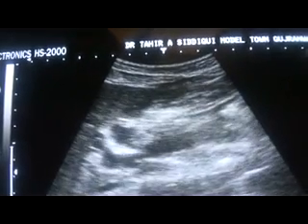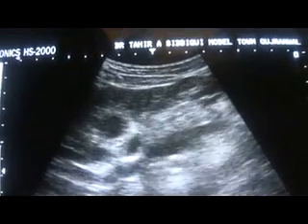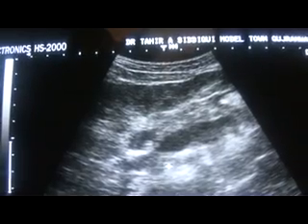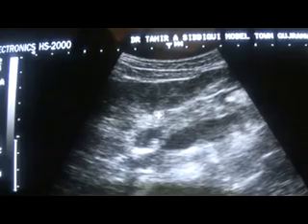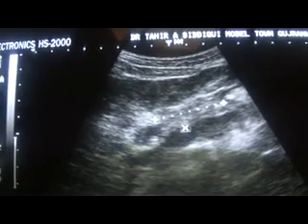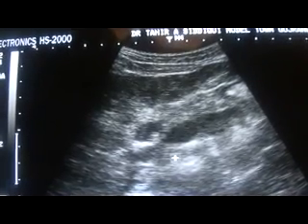This is common bile duct. And this is the liver. So this is the pancreatic head, and you know that the common bile duct crosses the posterior inferior surface of the pancreatic head. So you can see the common bile duct at the posterior inferior surface of the head of the pancreas in longitudinal section. Now the gallbladder in transverse section.